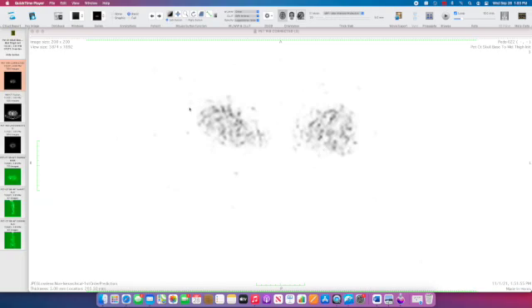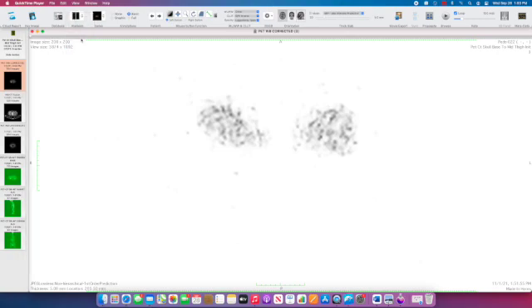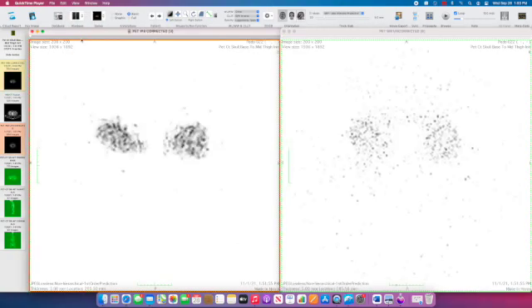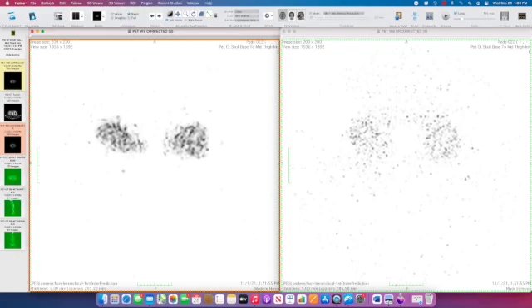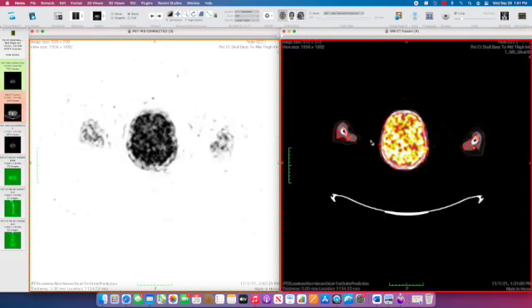My recommendation would be to review with two windows. In one window have the PET corrected data, which we have here on the left, and the second window I would drag the CT images. The software will probably automatically fuse them in one of the windows.